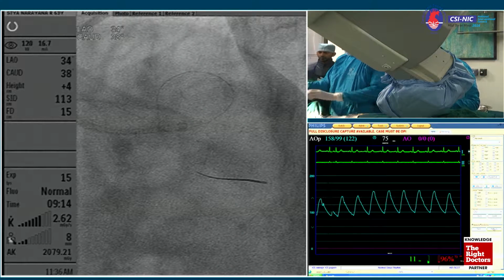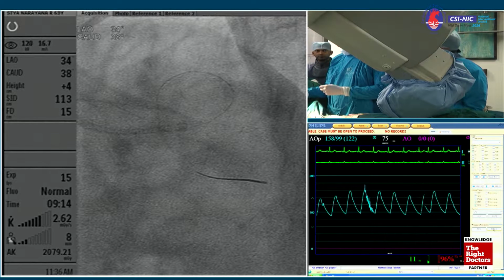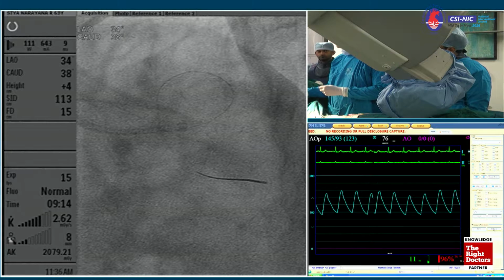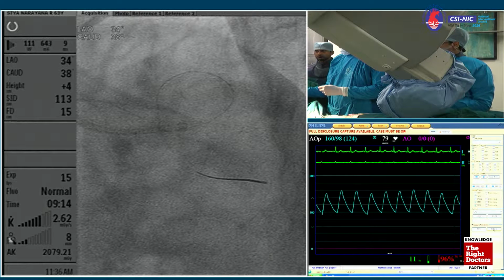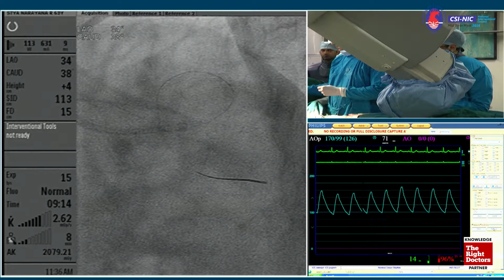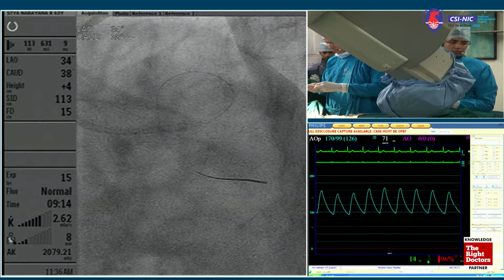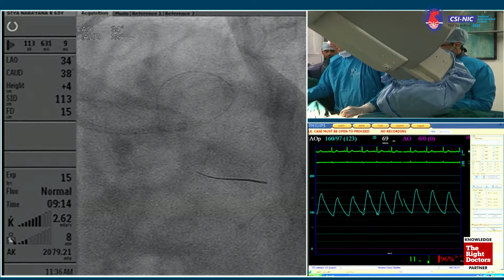Dr. Clare has made a comment that this is a really complex case, with a SYNTAX score of 22. Of course, if you go by the recommendations of all our associations whom we believe a lot, bypass surgery is the first choice. But if the patient has decided on an intervention and this can be done today so easily and effectively, I think that's a fair enough option, though it may not be the number 1 option. Having said that, for me, left main still remains an imaging-guided intervention.